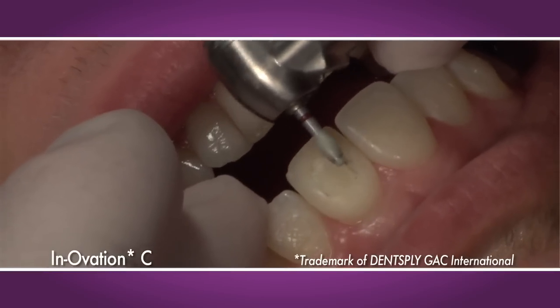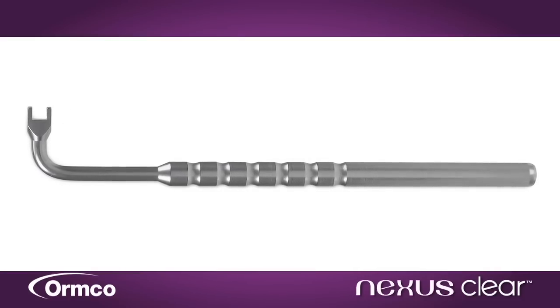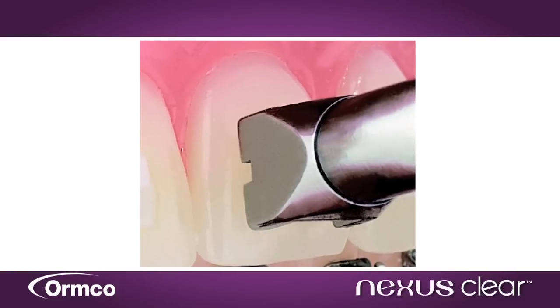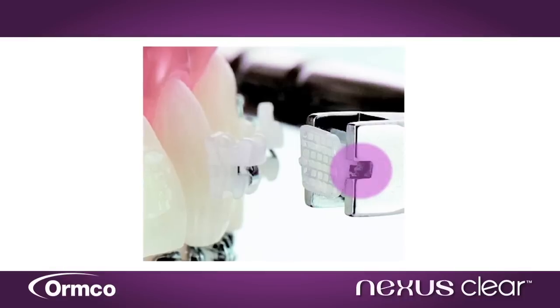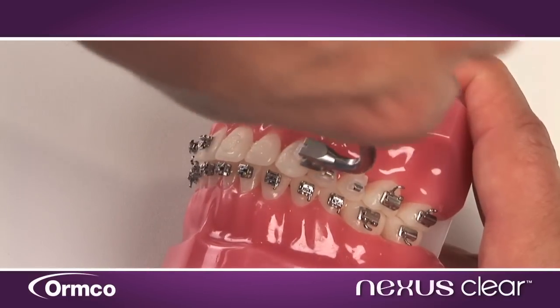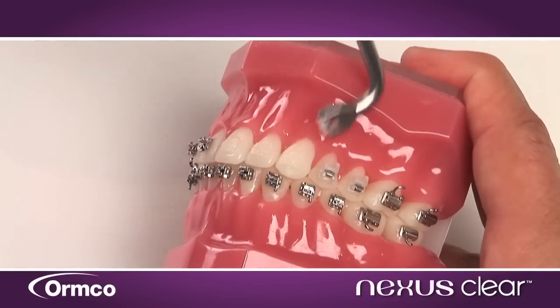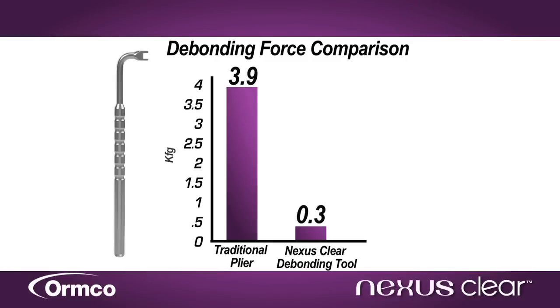In contrast, Nexus Clear delivers fracture-free debonding. The ambidextrous Nexus Clear debonding tool fits the bracket's proximal surfaces. A horizontal slit on each side of the tool perfectly aligns with the arch wire slot. Using simple distal or mesial leverage pairs the bracket from the tooth quickly, efficiently, and fracture-free, all with only a fraction of the force required with traditional pliers. In fact, Nexus Clear debonding requires only 8% of the force compared with debonding brackets such as Innovation C.